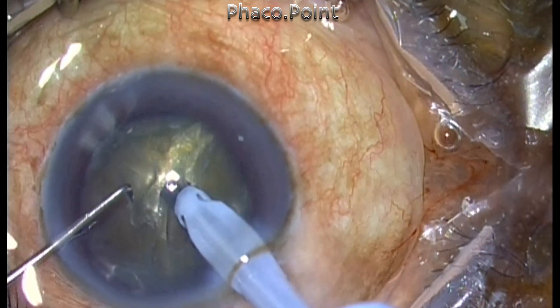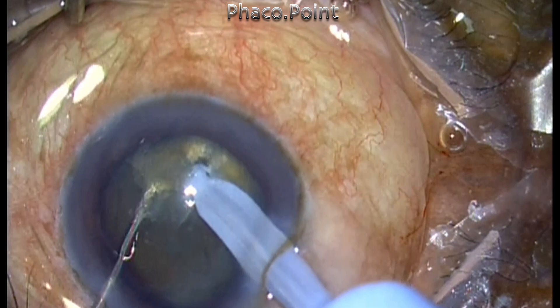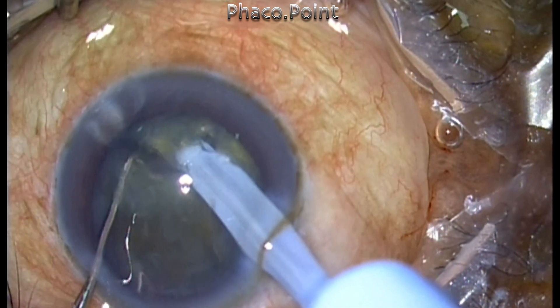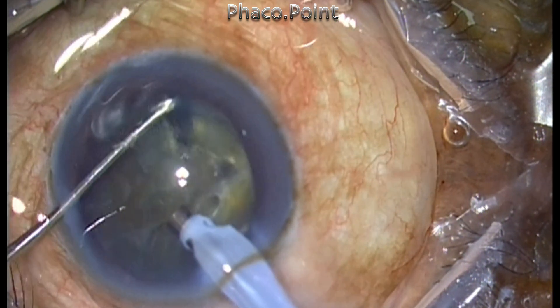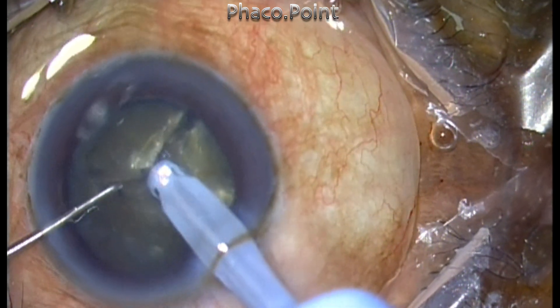I then proceed to create the other fragments. I initiate the chop and then create the separation. Remember, it is very important to make sure that the fragment separation has gone through and through, and you don't have any small attachment in the posterior base plate.